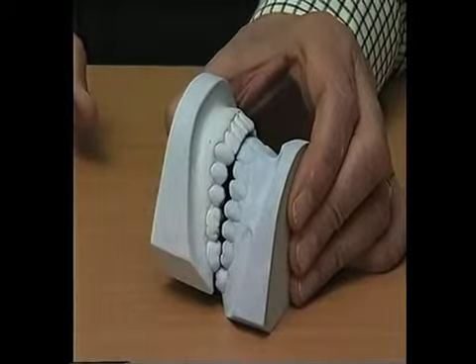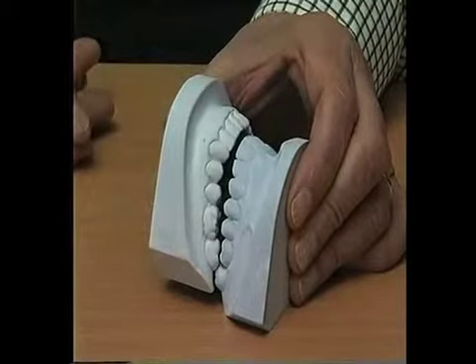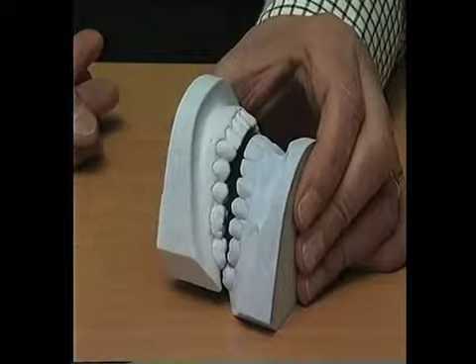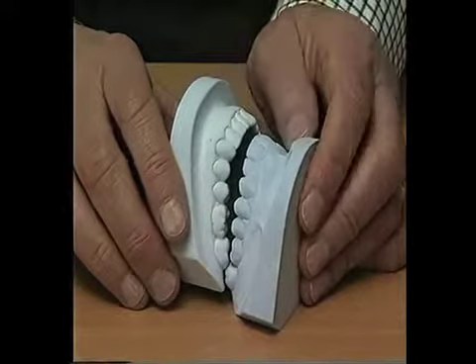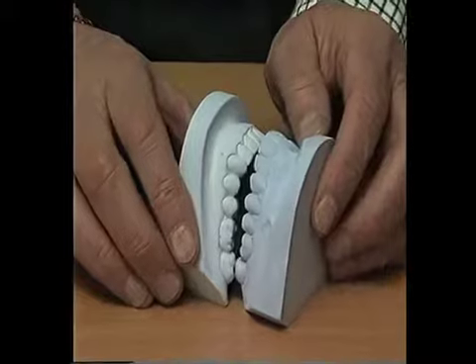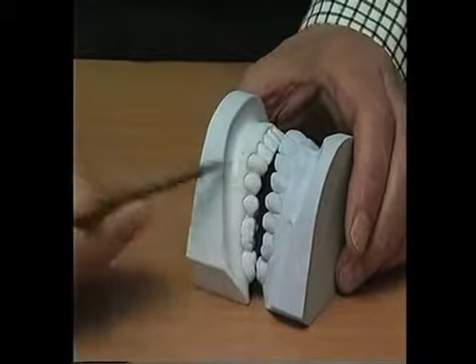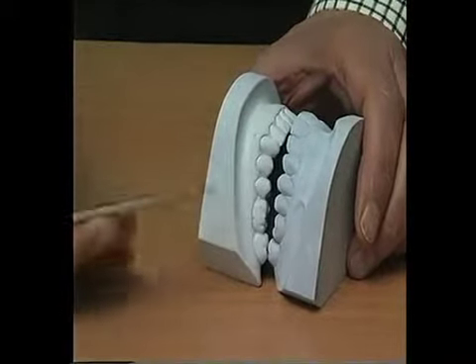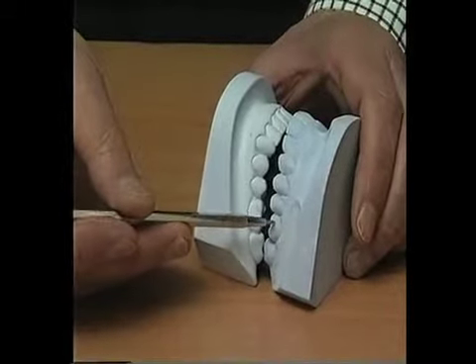I would like to draw your attention to the fact that if we reduce the back measurement, we can see how the model doesn't fall and it lays on the top of the table. This is a very important hint for me. If I move slightly the model, it falls down. Therefore, I reckon that the problem is on the level of the seventh. We will cover the issue of the slipping between the sixth and the seventh molar on the verticality plane.